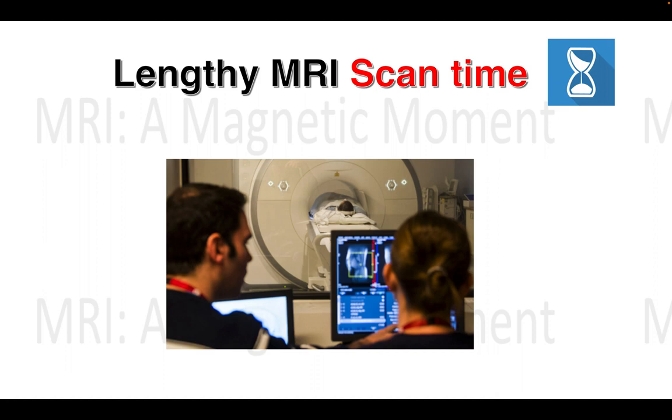So the timing of MR scans can be a disadvantage, and as MR technologists, we continuously fight the battle to reduce MR scan times without compromising the image quality, of course.